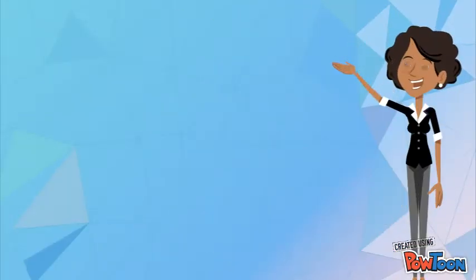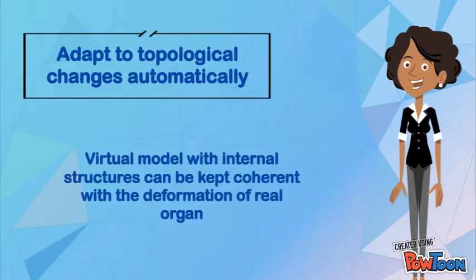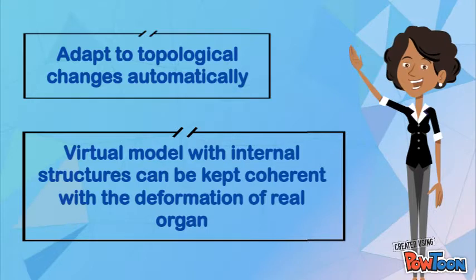This application can adapt to topological changes detected in the intraoperative model automatically. Besides, the virtual model with internal structures can be kept coherent with the deformation of the real organ after an incision.